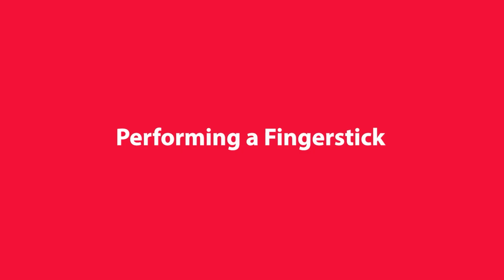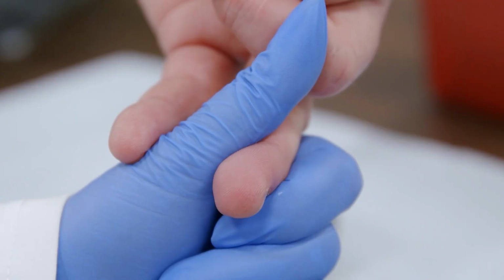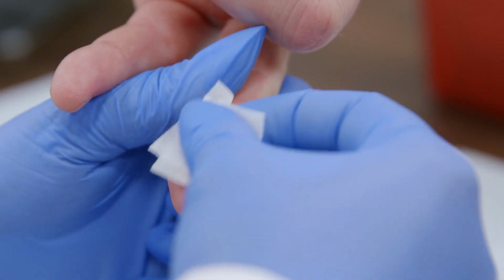Now, perform a finger stick on the patient and collect a sample. Decide whether you will collect the sample from the middle finger or ring finger. You can ask the patient which they'd prefer. Clean the finger with an alcohol wipe. Make sure the finger is dry before proceeding.